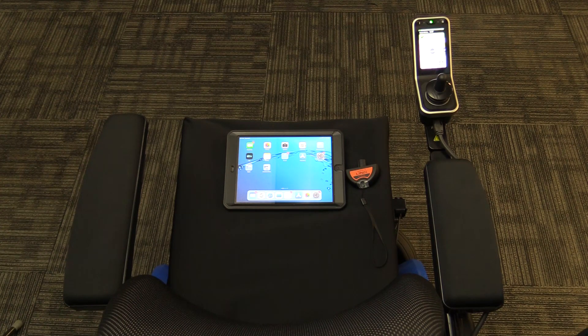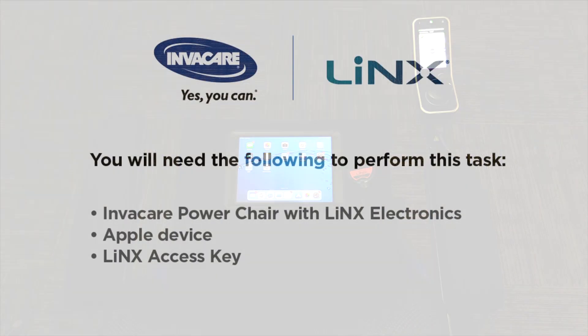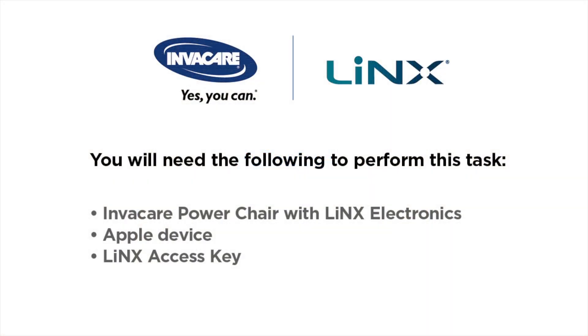You will need the following to perform this task: an Invacare power chair with Lynx electronics, an Apple device, and a Lynx access key, a LAC.